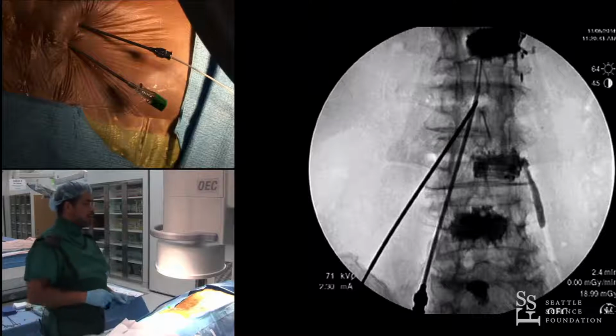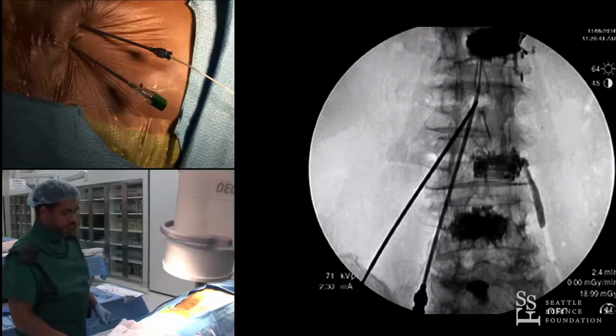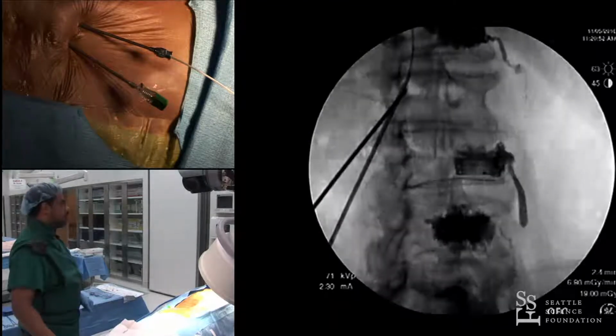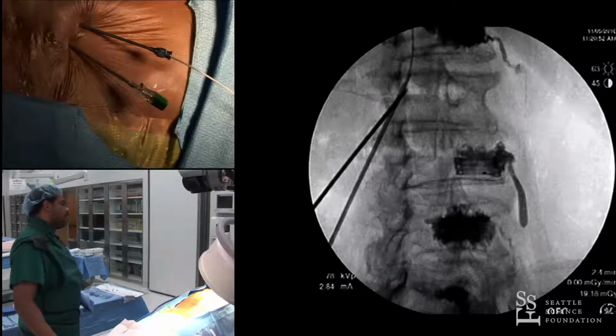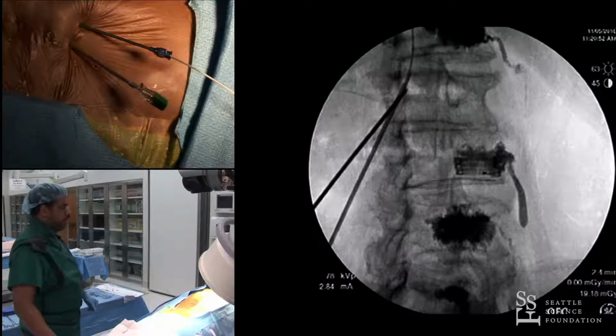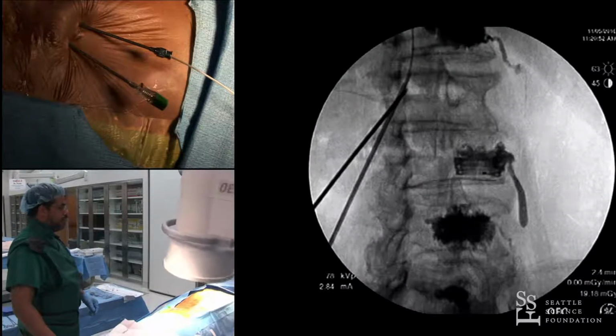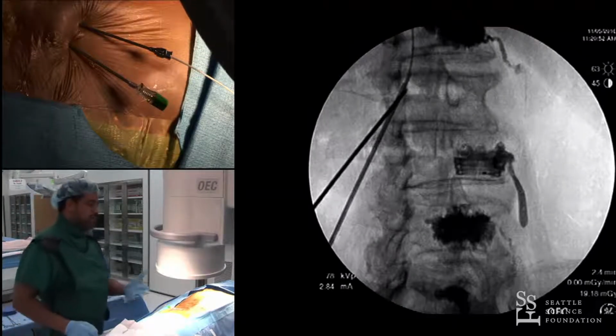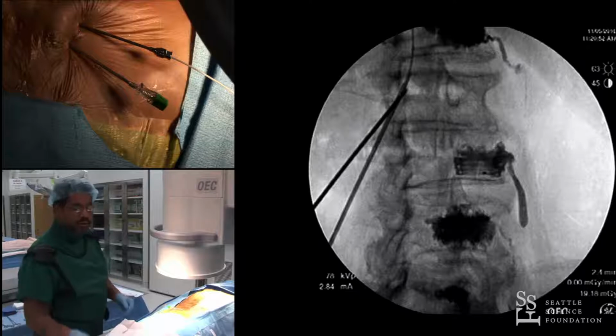All right, let's take that contralateral oblique view again. So you can see it just a tad bit steeper than the other, but close. And let's go back to AP. So ideally, maybe a little bit less of an angle, but I'm still less than 30 degrees on this one as well.